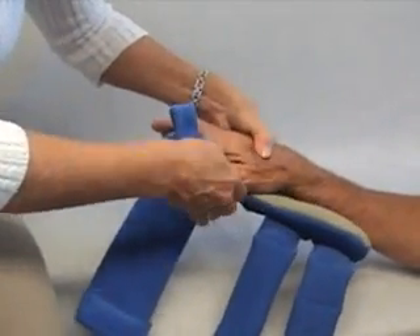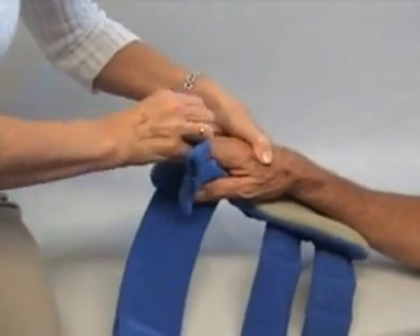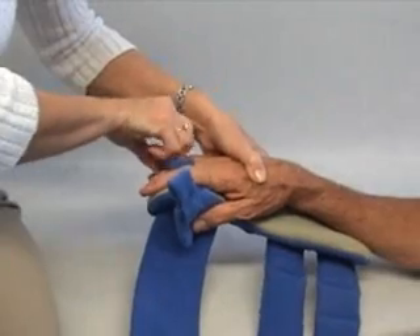Don't extend your thumb — that's very painful and we want to be very careful with our patients.